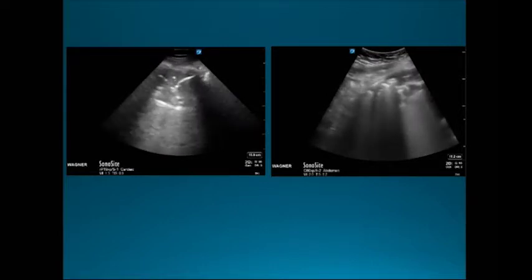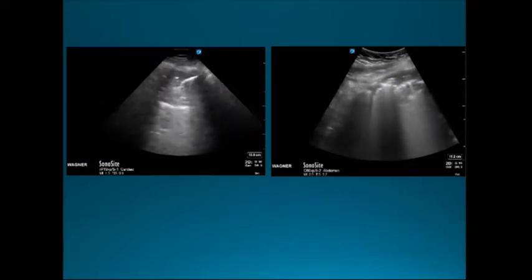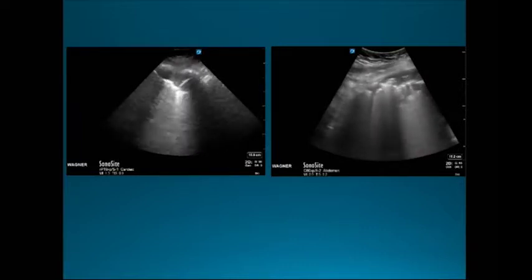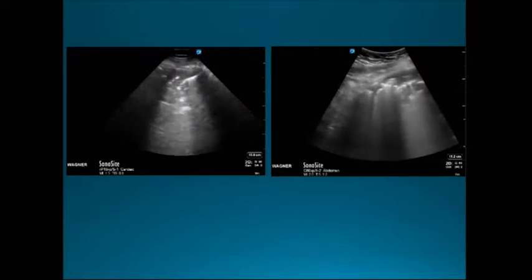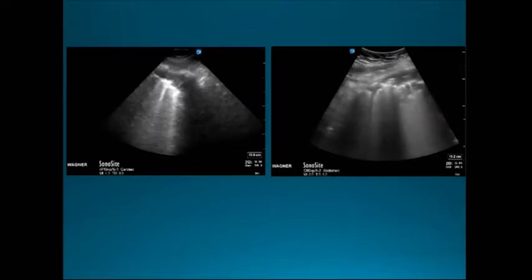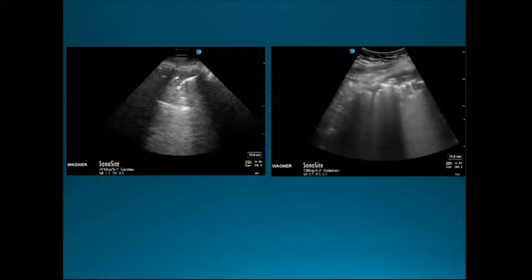That little chunk is normally not there. Usually it's all artifact. You can't see tissue. Well, this looks like tissue, and normally you don't see tissue appearance in the lung. It usually looks like air artifact. This is a different look. It has tissue-looking stuff here, and then all these B lines coming off of it. And this is what pneumonia looks like with ultrasound. And so this could have been easily recognized as the cause for her feeling poorly, dizzy, feeling sick, and then having the fall, and then having resistant AFib with RVR that wasn't responding to your traditional therapies.